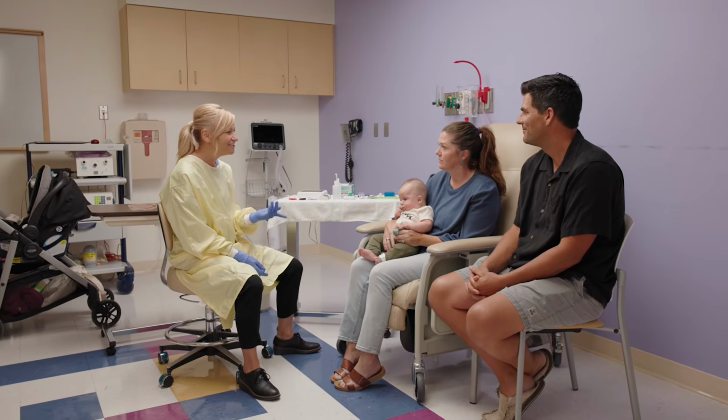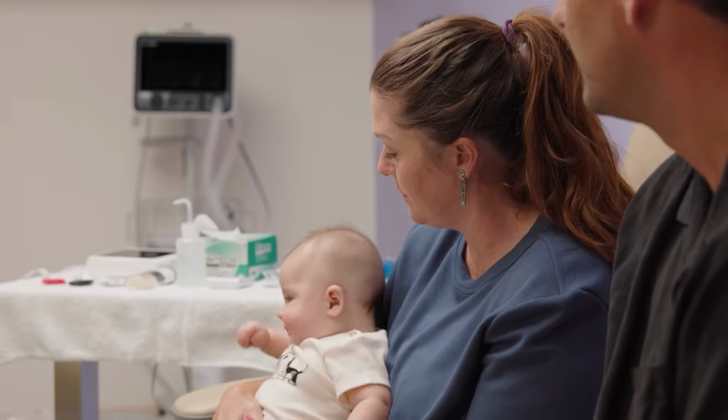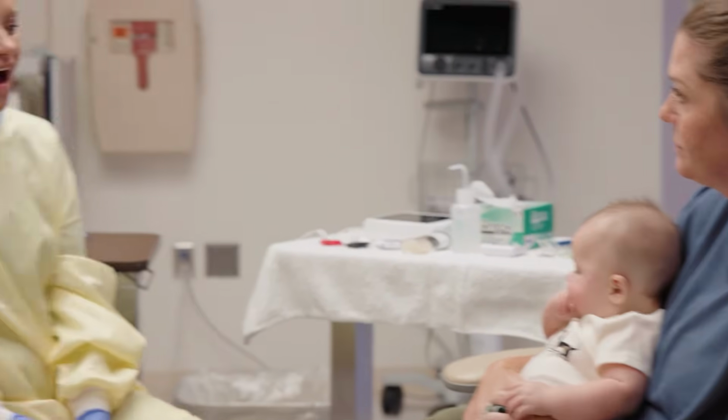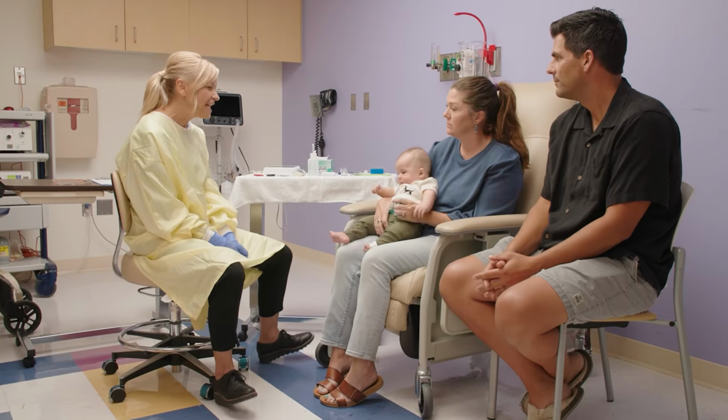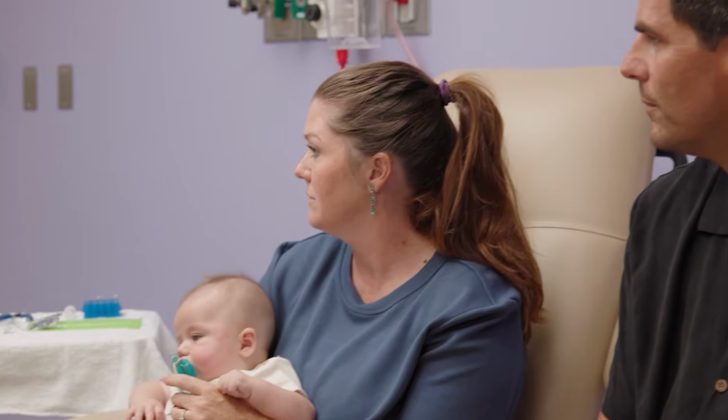When meeting the family, take a moment to provide a brief overview of the procedure. Let them know the procedure typically takes about an hour. While the test isn't painful, children may feel a mild tingling or warmth at the site. It's also normal for some young children to cry or become upset. Preparing caregivers for what to expect can help reduce stress if the child becomes fussy.